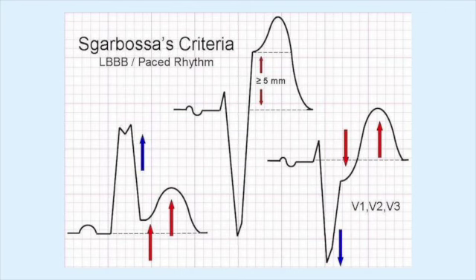If it stays elevated, meaning it stays above, it doesn't cross back over, it stays up, it's elevated and it's considered a STEMI. If it goes down and doesn't come back over but stays down, depressed, it's considered a STEMI. So right here, you look at this one right here. This is the most important finding. This is the most significant. This right here is not as significant.